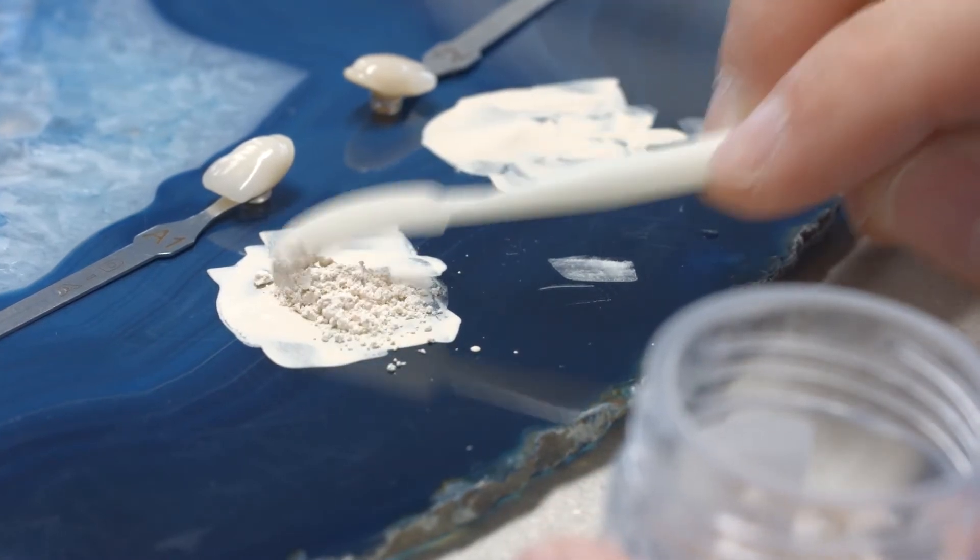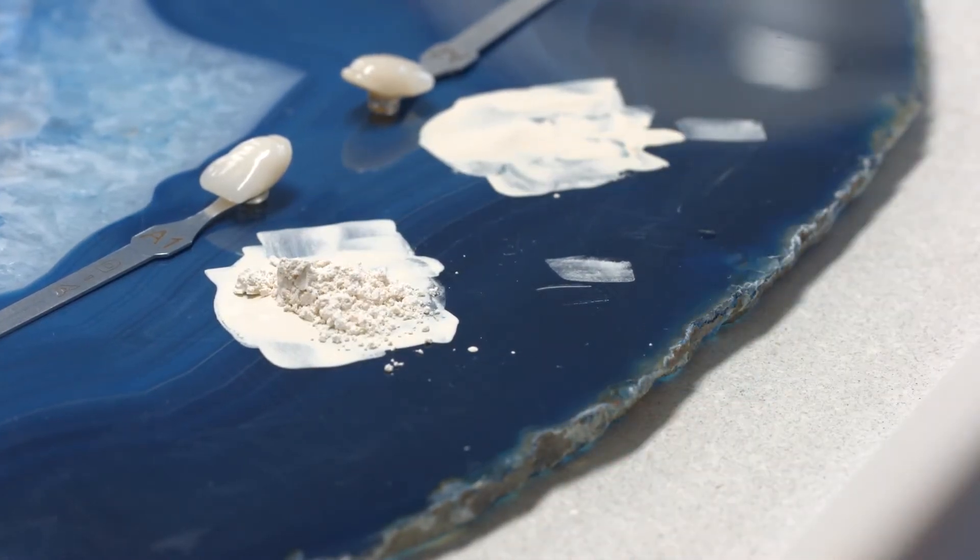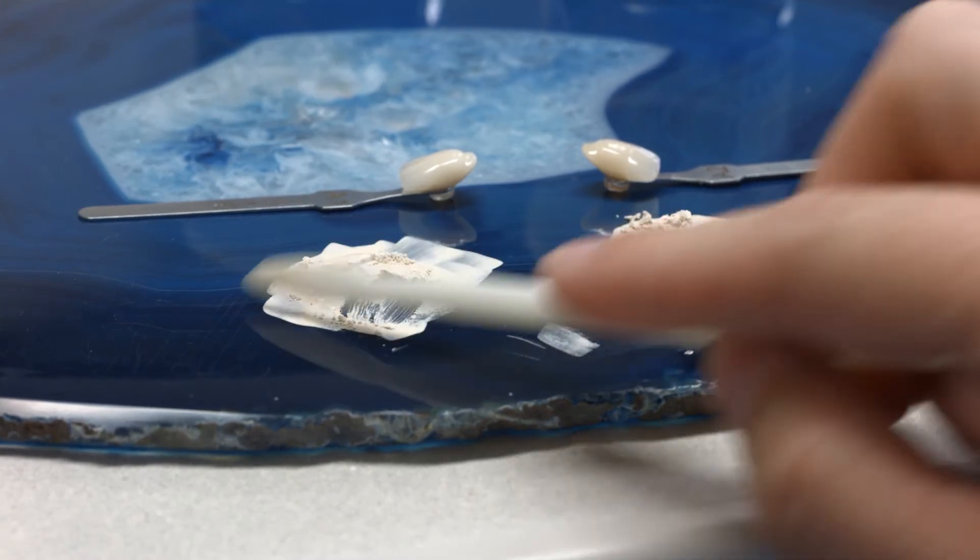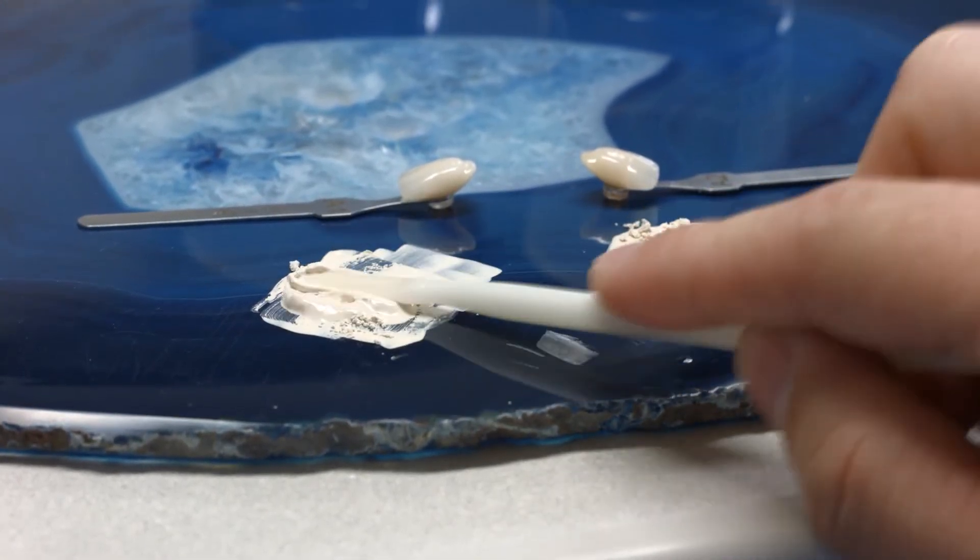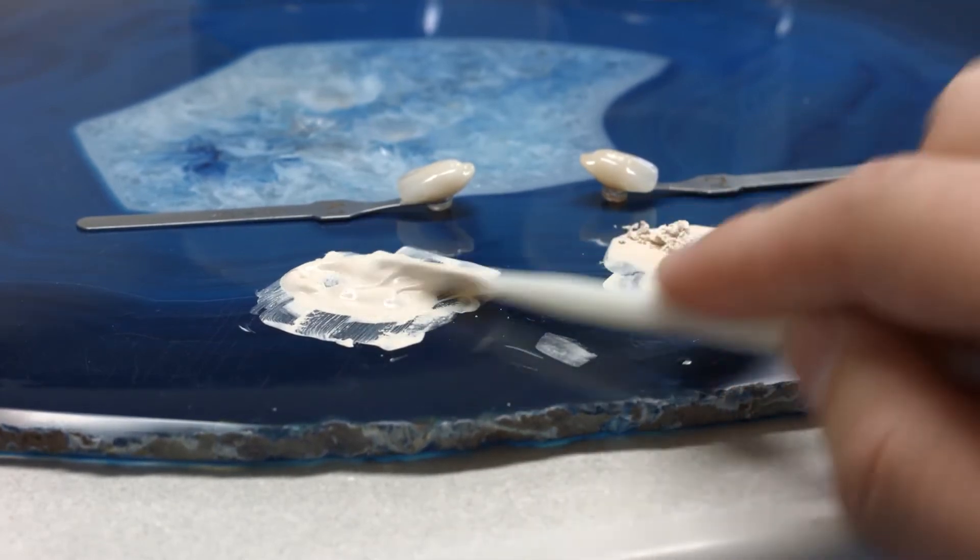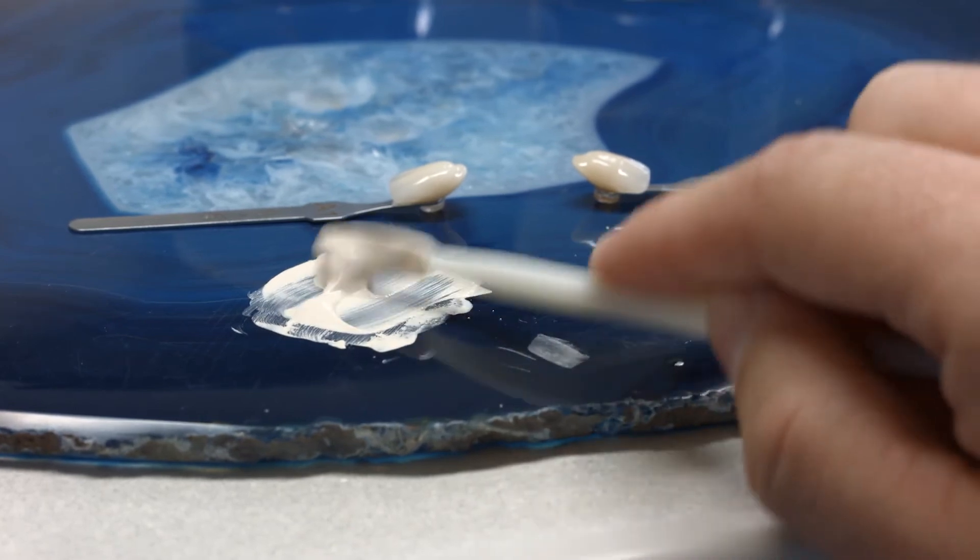Remove the amount of opaquer powder required for the covering layer from the jar and add it to the dried wash-opaquer residue on the mixing pad. Mix the opaquer powder to the desired consistency with some of the opaquer powder liquid.